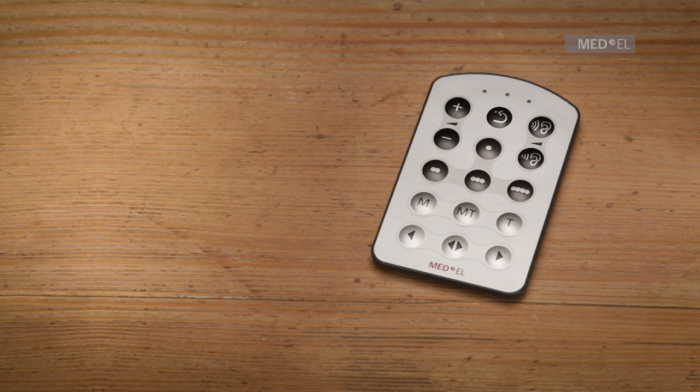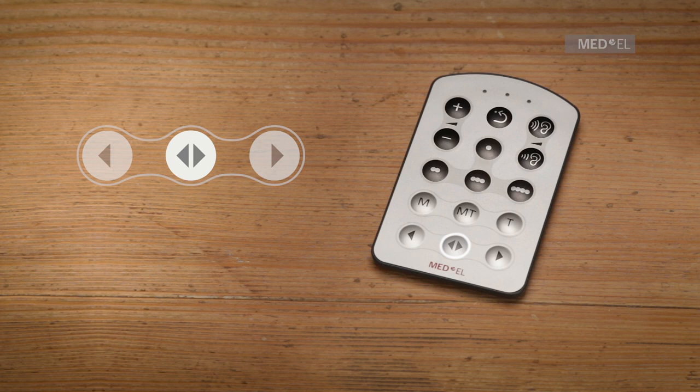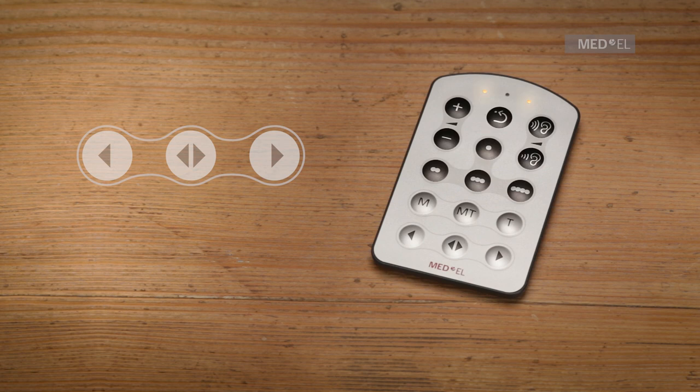To activate the keyboard lock feature of your fine-tuner, hold down the double arrow key for more than five seconds to enter the program mode. The red and both amber indicator lights on your fine-tuner will start blinking alternately, indicating that you have successfully entered the fine-tuner's program mode.